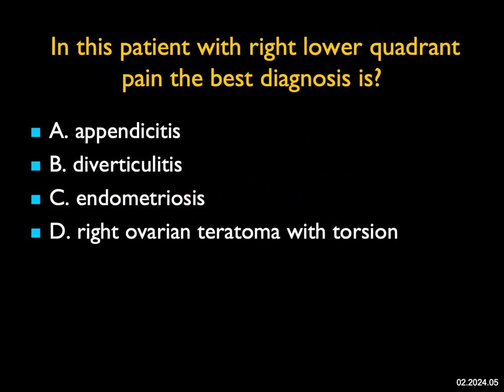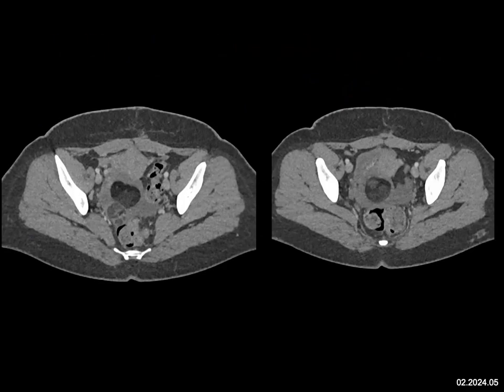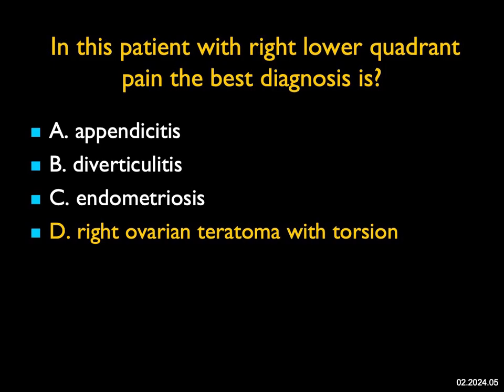In this patient with right lower quadrant pain, what you see here is a mass in the pelvis and there's free fluid representing blood. The mass is of partly fat density, which makes you think about a teratoma or a dermoid. Endometriosis can present with solid masses, but not fat. This is not a case of diverticulitis or appendicitis. So this is a patient with right ovarian teratoma with torsion. Sometimes you can see the torsed ovary and the lead point to it; sometimes you can't, especially when there's lots of blood present.